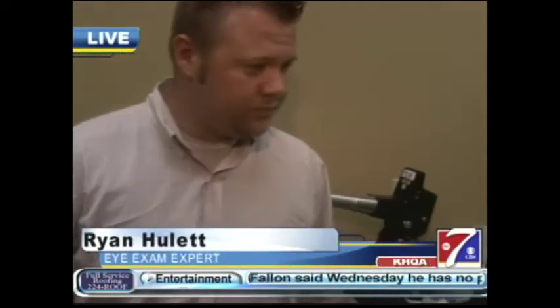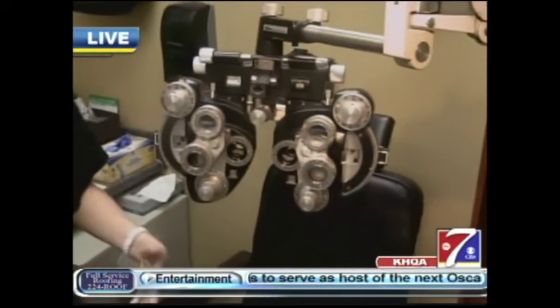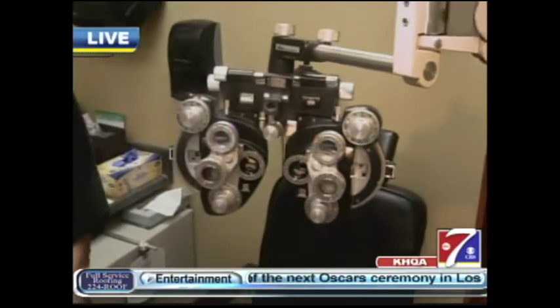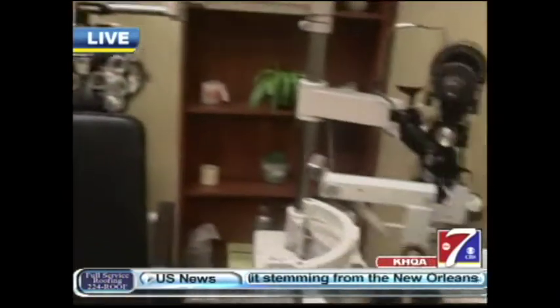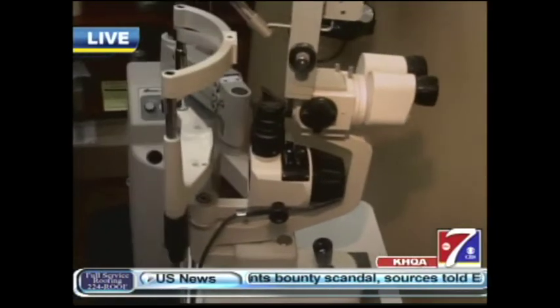And this is for adults, this is for kids, so when the kids come in after the first room, they'll come in here and sit down, and then what? Exactly. The doctor will sit the patients down, especially kids, and explain exactly what they're going to do. That way they don't get scared. The next machine here helps the doctor see the health of the eye. It's a very bright light, so that can scare the kids a little bit, but the doctor makes it comfortable for the patient.